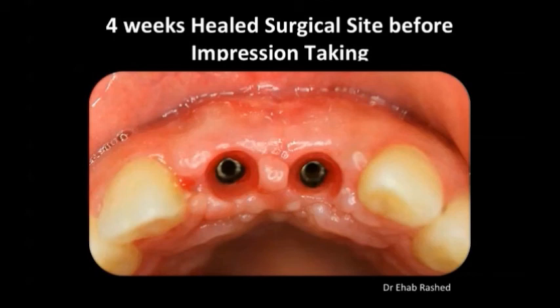And as you can see, 4 weeks later we get nice healing, and the area is ready for taking an impression. As you can see from this picture, we imitate the bulge of the root, as you can see on the implant on the right side and the implant on the left side, and both implants have a good thick mucosa. They are placed in the proper position. We have a good thick mucosa buccally. We have enough bone on the buccal side. The position of the implant is in the correct area. So this is implementing all the factors that we discussed at the beginning, and that leads to this result.